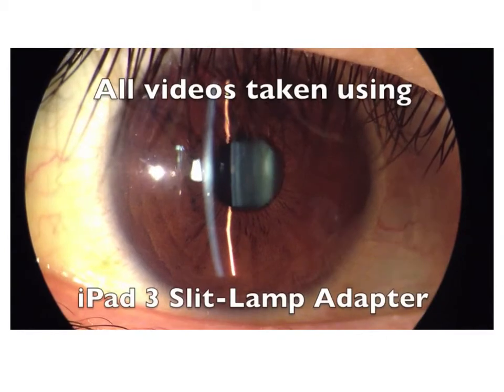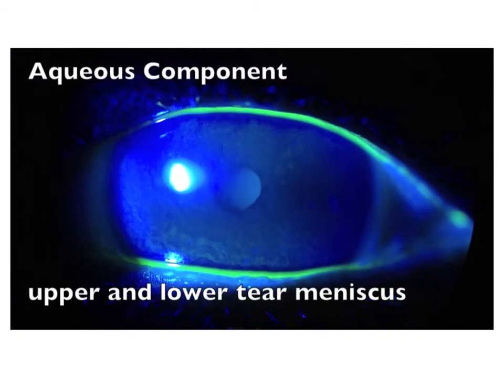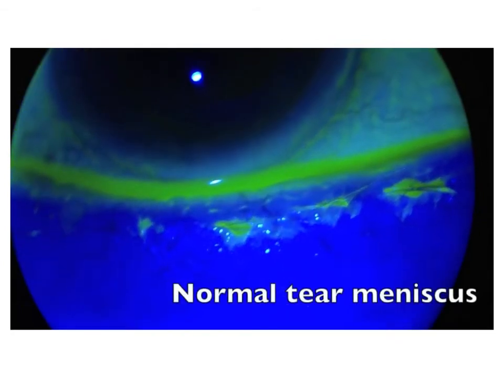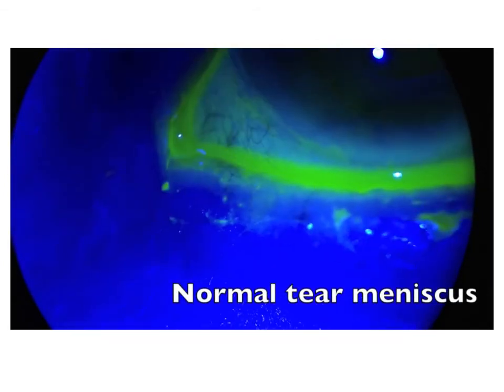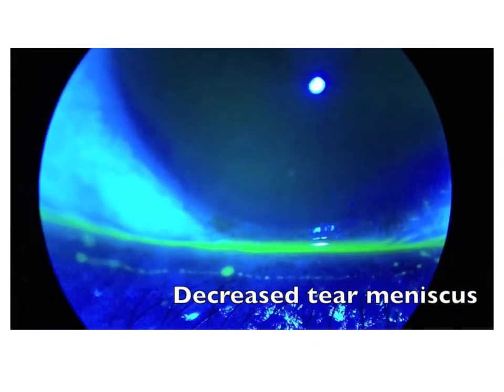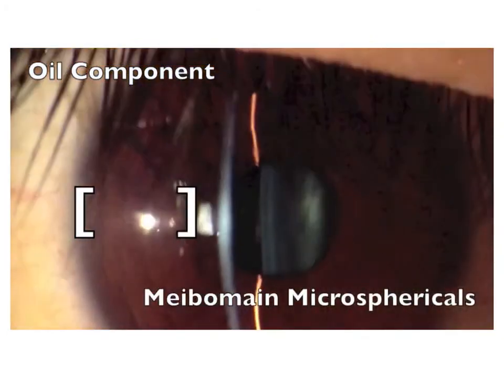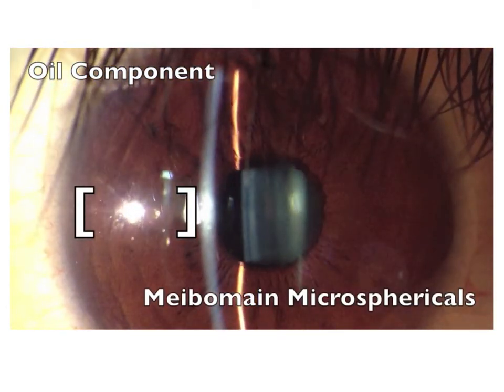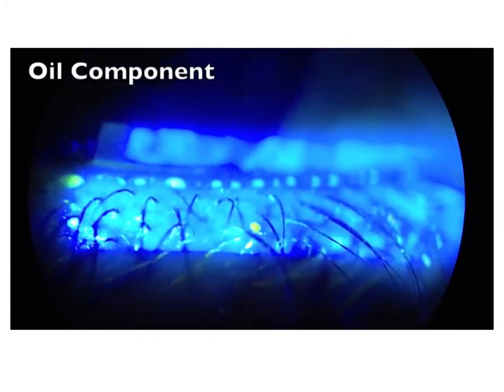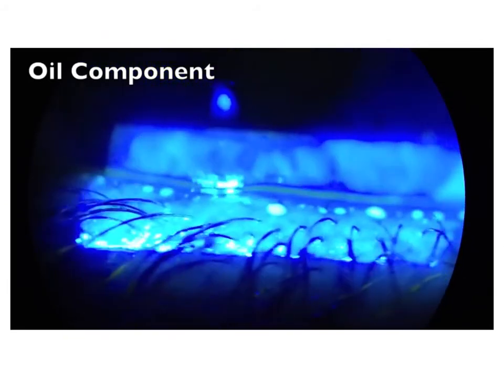Here's a dynamic tear film analysis. All the videos were taken with an iPad 3. The first step is looking at the aqueous component, both the upper and lower tear meniscus. There's a yellow barrier filter. This is what a normal tear meniscus looks like — it's robust — as compared to a decreased tear meniscus. This is where we would add them on artificial tears with castor oil and a secretagogue. Here are the meibomian microsphericals. If you look at the spot on the slit beam, you can see them moving around — that's from the meibomian glands. This is what meibomian looks like on the lid margin, highlighted with fluorescein.